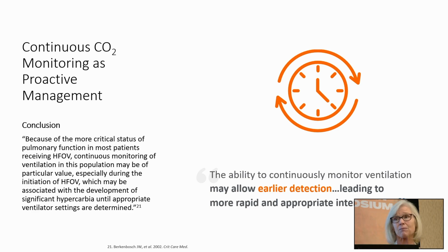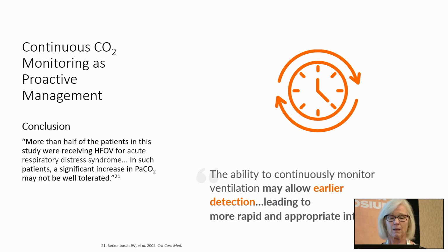So this team that was specifically looking at transcutaneous use in patients who are on the oscillator really did appreciate having that real-time value so that they can manage these patients more tightly. And they concluded that it was a viable option, an alternative to doing a bunch of blood gases.